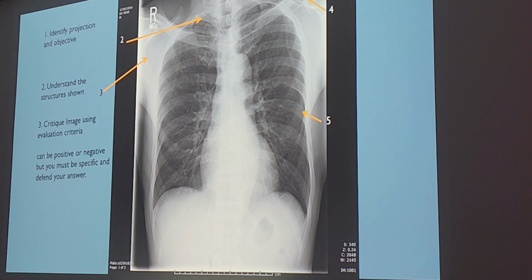With the heart, I think they said not to go by that because sometimes it could be. What about the ribs? If it's AP, they'll be shorter and wider. That's what I got on my lecture yesterday from Mr. Fung. I might have written it wrong, but that's what he said. The ribs would be projected differently.